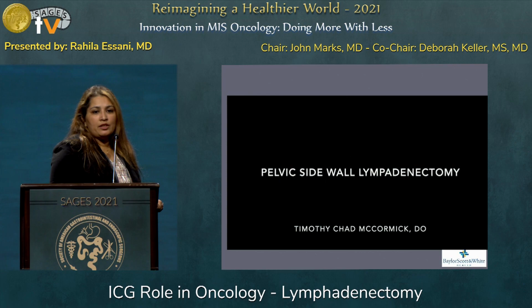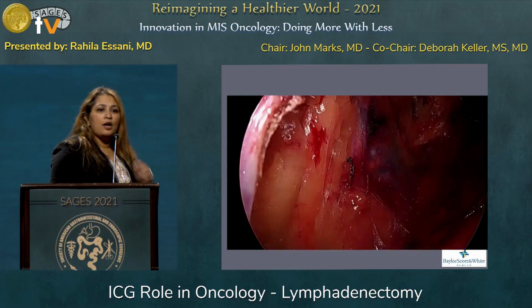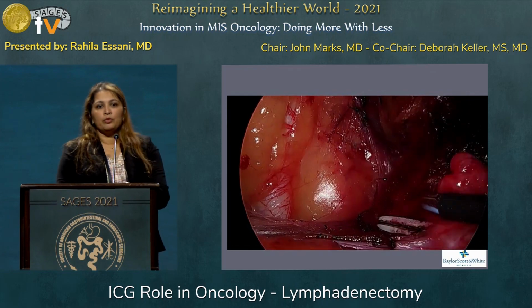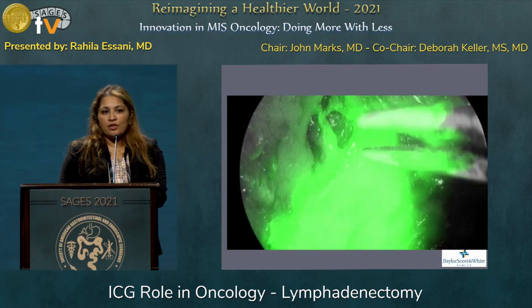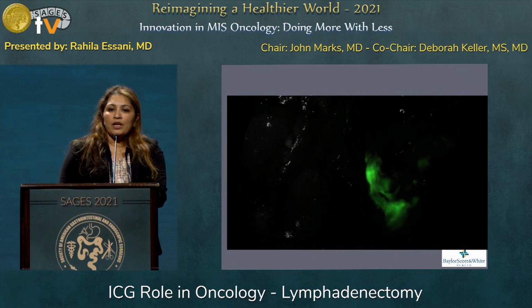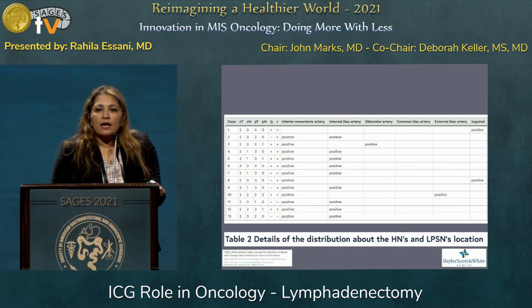This is a video by Dr. Chad McCormick. He gives ICG 1 cc in the cervix prior to starting the surgery, and once he's done the hysterectomy, now he's proceeding to do a pelvic side wall dissection. You just saw the iliac artery onto the left, and the pelvic side wall lymph node highlighting with the ICG. It's hard to see. Okay.